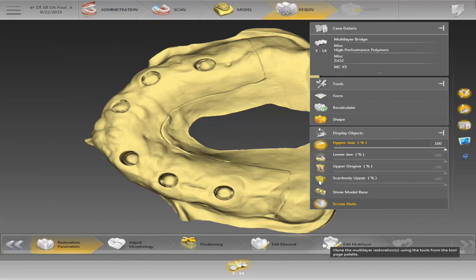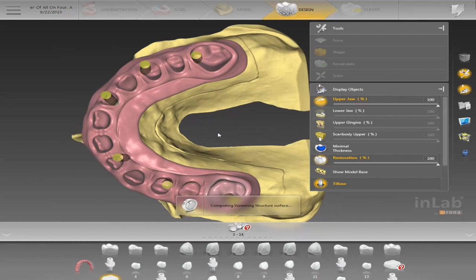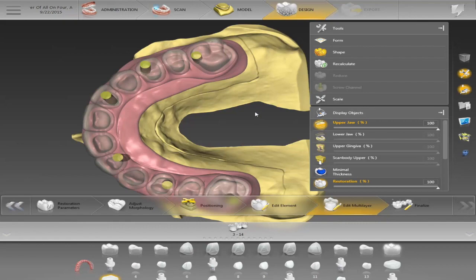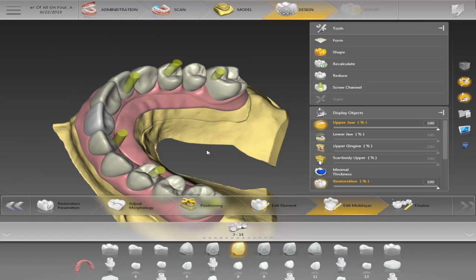You'll see on the bottom right it added 'edit multi-layer.' On the other setup it went straight from edit element to finalize, but now it's going to split the two — you'll have the bottom layer, which is Trilor, and your crowns on top. Right now I have it set up as a bridge, so it could be a zirconia bridge on Trilor if you want to go that route. If it's a bridge, make sure you have your connectors — all the teeth need to be touching and the contacts need to be connected.